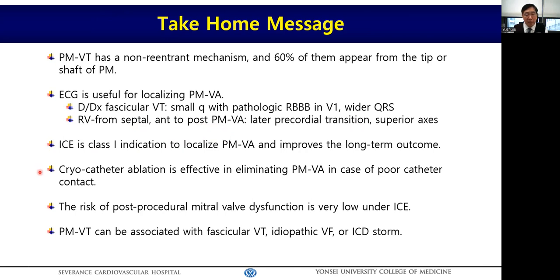And cryocatheter ablation is effective in eliminating PAP ventricular arrhythmia in case of poor catheter contact. The risk of post-procedural mitral valve dysfunction is very low with the ICE-guided procedure. Finally, PAP ventricular arrhythmia can be associated with fascicular VT, idiopathic VF, or ICD storm.